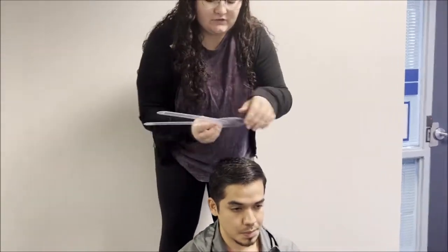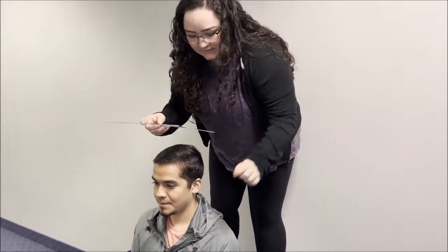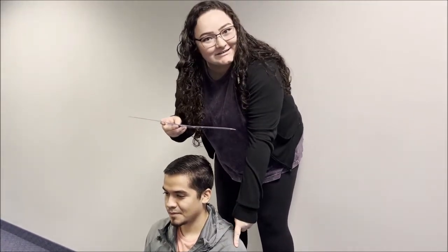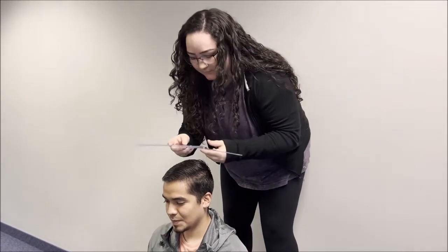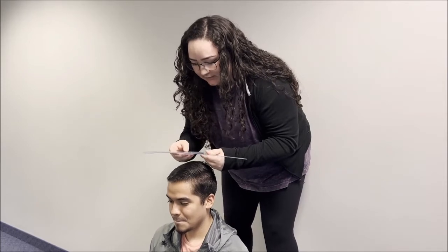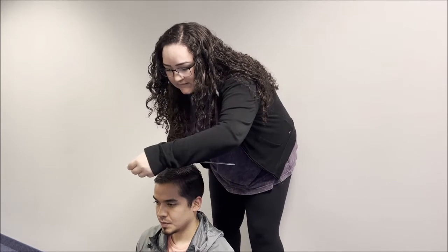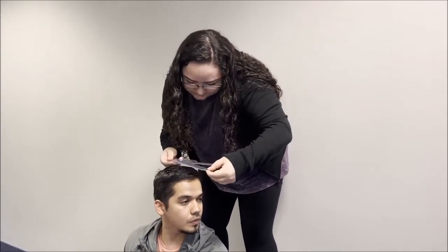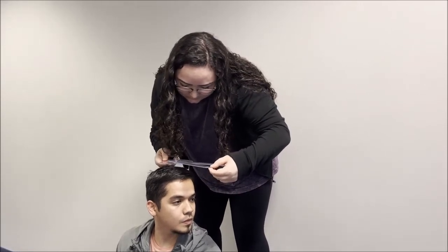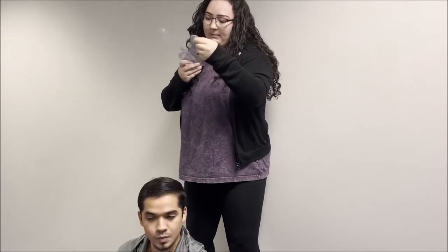I'm going to have him return back to neutral, and I'm going to flip the goni around so that the stationary arm lines up here with his acromion, which should be right about there. Fulcrum is in the same spot. All right. And moving arm is parallel with the nose. Go ahead and look to the left. All right. And he has about 61 degrees of motion on the left side.